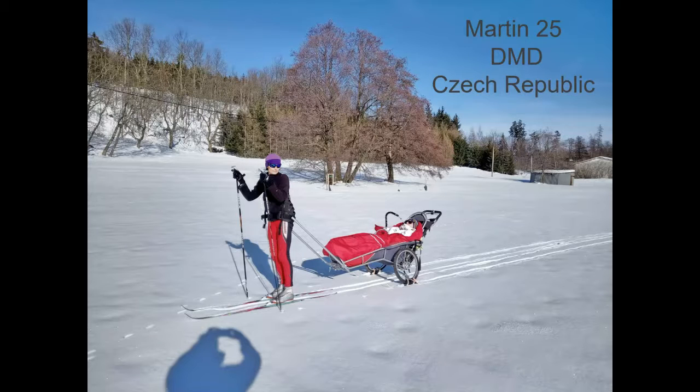And you see here, he's enjoying the snow with his mother. But you see, he's using the mouthpiece here on his sledge, and he's doing the same on a kind of sledge with the bicycle in the summer.